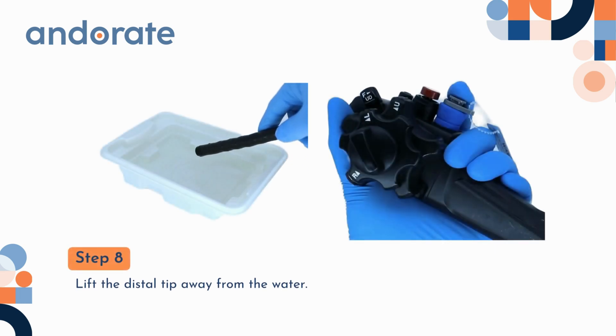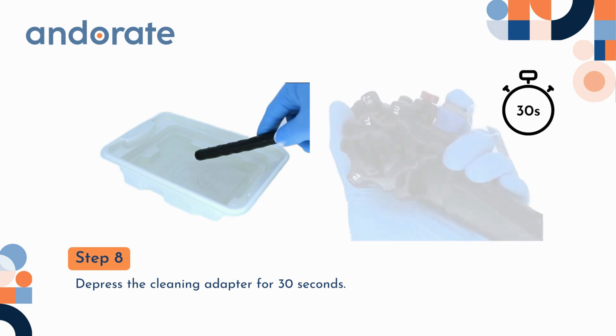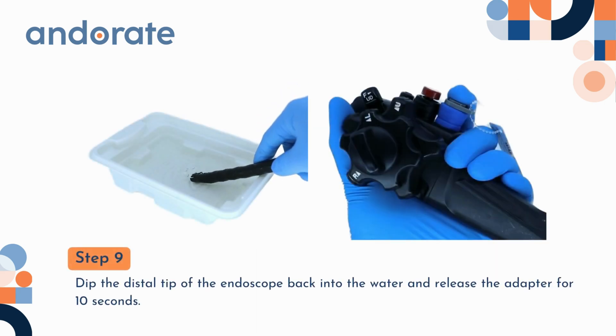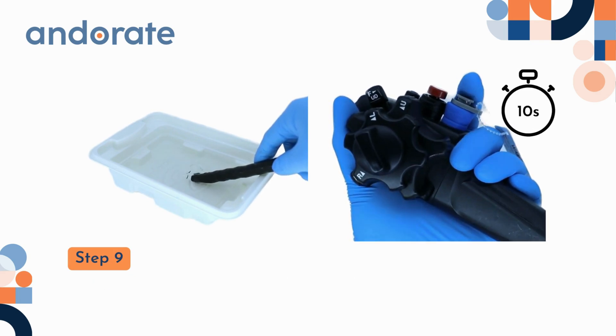Step 8. Lift the distal tip away from the water. Depress the cleaning adapter for 30 seconds. Step 9. Dip the distal tip of the endoscope back into the water and release the adapter for 10 seconds. Watch for bubbles to confirm the air flowing through.